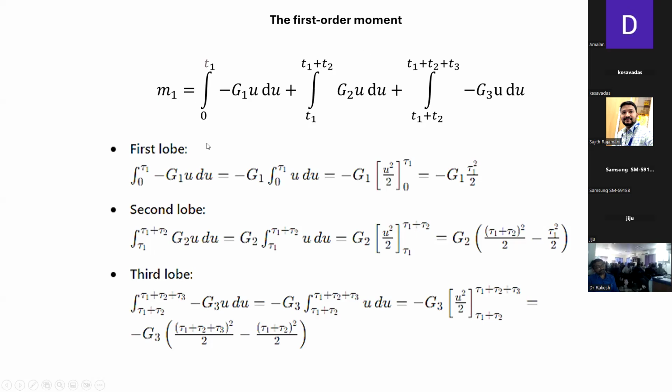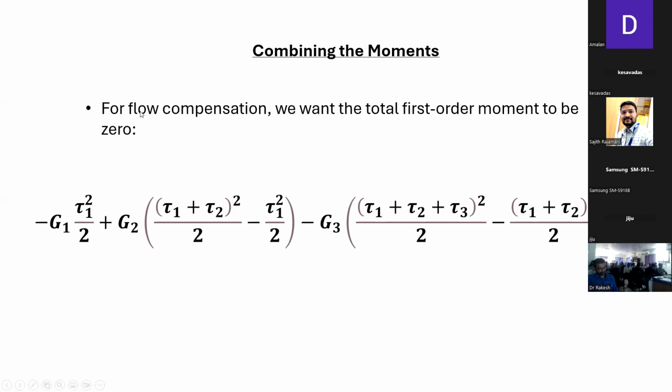So again, if we calculate all these things, the gradient design criteria should be in such a way that there should not be any net phase shift. So after the integration, if we sum up all these gradient moments, finally we will end up getting 0. That means we don't have any kind of phase shift if we apply flow compensation gradient along the flow direction.